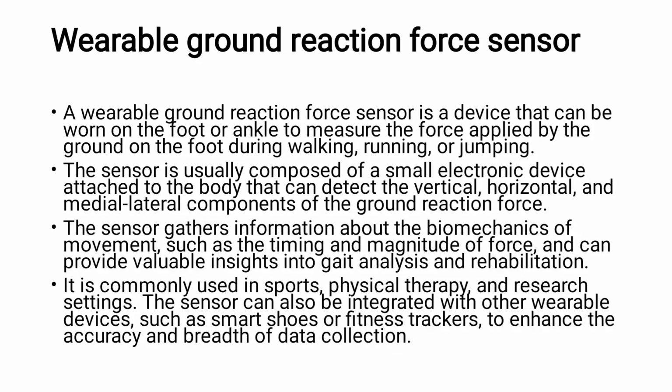This is a device that can be worn on the foot or ankle to measure the force applied by the ground on the foot during walking, running or jumping. This sensor is mainly composed of a very small electronic device that is attached to the body.